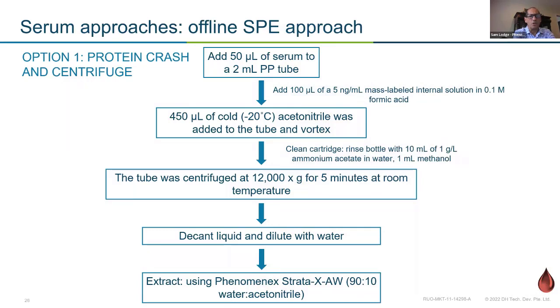Coming to the end, folks, we're talking about serum. Similar to food, we're starting to see more and more work with PFAS and serum as more studies are done in the toxicology and epidemiology branches of our science. We're identifying the problems with these compounds. We know they're in the water, we know they're in the soil, we know they're in our food, but one of the missing components is the actual physical biological impact that these compounds have on living systems. So as more and more studies are being done on PFAS within organisms and within serum, more work has to be done to get these efficiently and effectively out of that matrix and into an analysis, so you're getting an accurate and quantifiable level of actual PFAS.